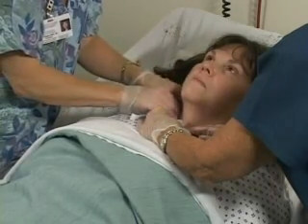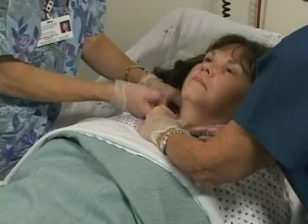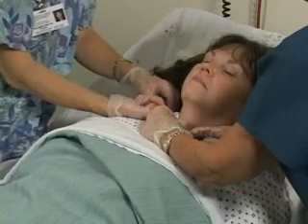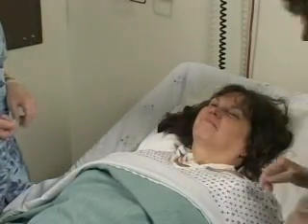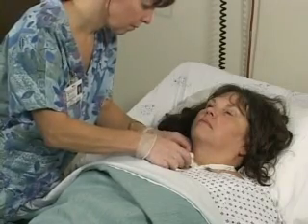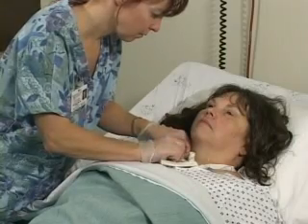Then tie the tracheostomy tapes with a double knot at the side of the neck to avoid any pressure source at the back of the neck. These tapes need to be snug enough to hold the tracheostomy tube in place while allowing one finger beneath the tape for neck movement. The second person can leave now and wash hands. There is a split gauze in the cleaning kit that will slide under the neck plate of the tube to provide a cushion for the skin and absorb secretions.